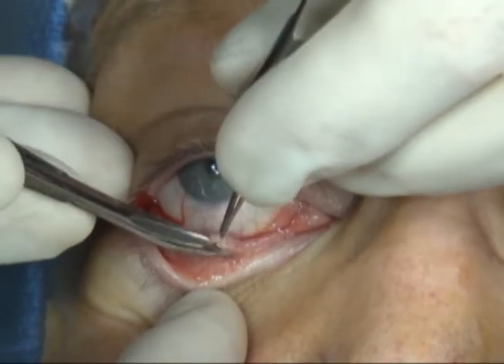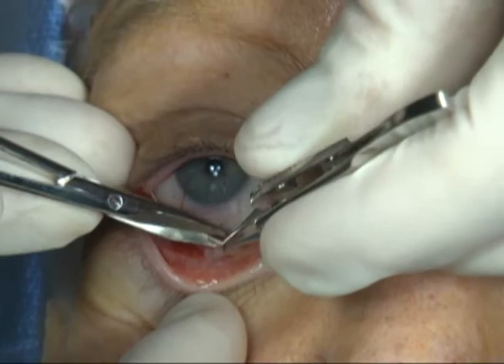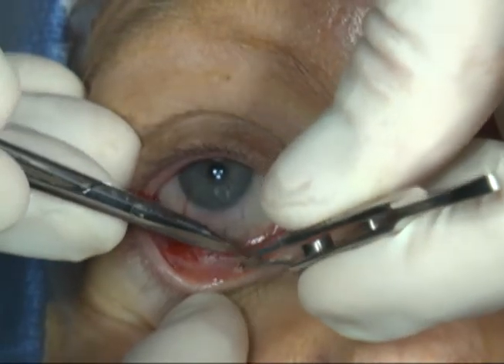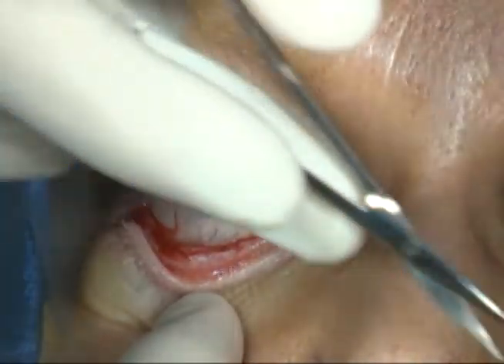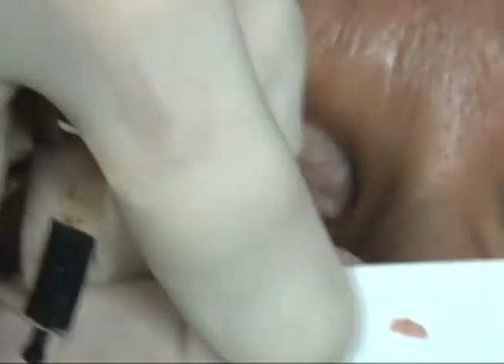This specimen will be sent for immunopathology and will be placed in saline-soaked gauze. This specimen needs to be sent immediately to the lab for evaluation.